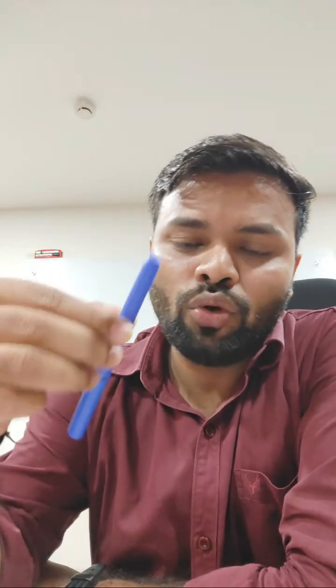Okay, now we will talk about the angles and the 3-point techniques. What should be the angle for cannulating a fistula? There is also no actual thumb rule for the cannulation angle, but generally you have to put the needle in the fistula at 25 degrees. You have to take a needle in your hand and insert it at 25 degrees on the patient's arm for the exact cannulation.